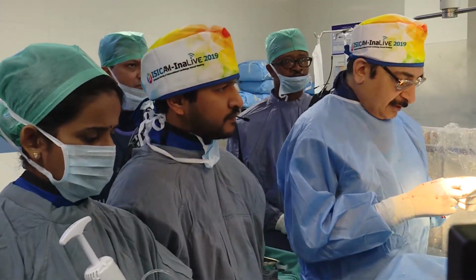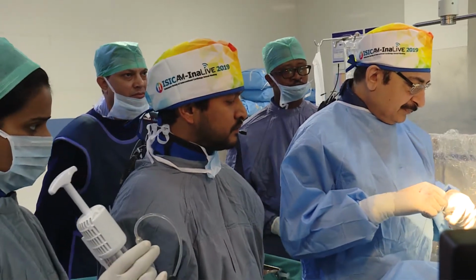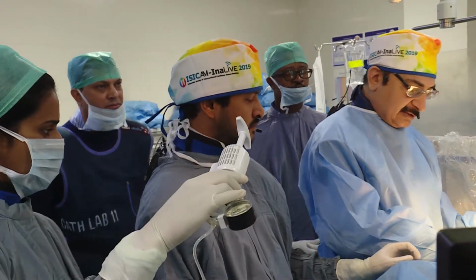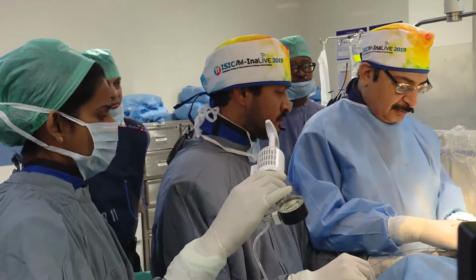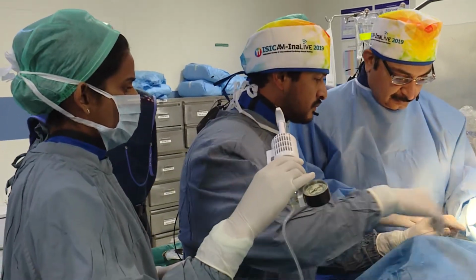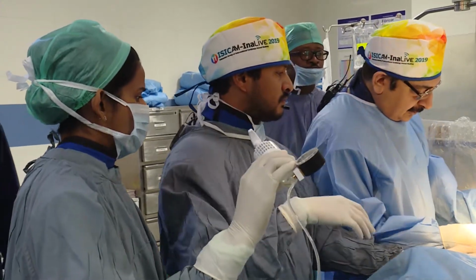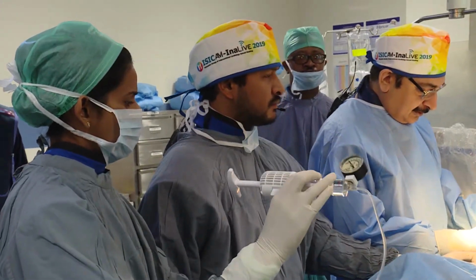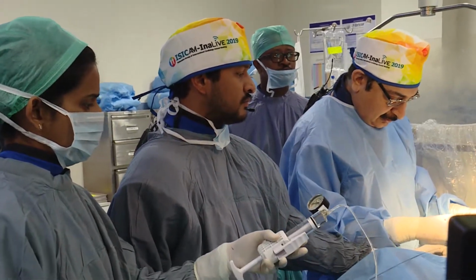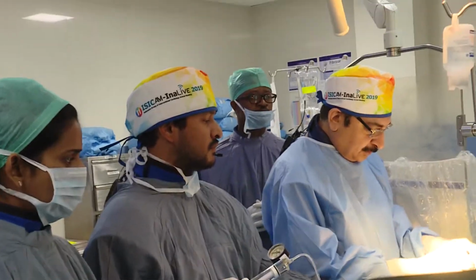But if there is a plaque shift in the LAD, or if there is a lot of recoil or a dissection, then in that case I have to stent, and we will go ahead with the bifurcation stenting. Ajit, what would your view be on this? How would you approach this lesion as a de novo lesion, and if you get into problems, what are you going to do? Well, I agree with your strategy, but it's very unlikely that you will get a good result with a cutting balloon at the end of the procedure with this sort of tortuosity. And I think, Khanna, you may be committed then to a bifurcation stent. Yeah, that is my plan too.